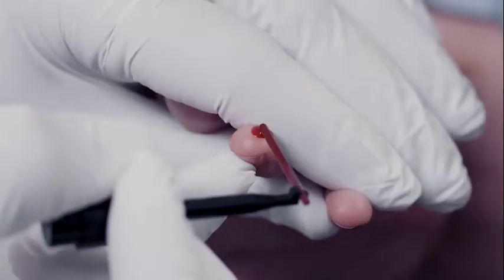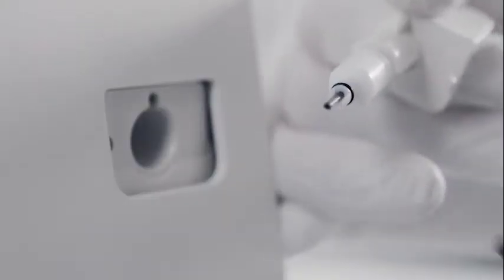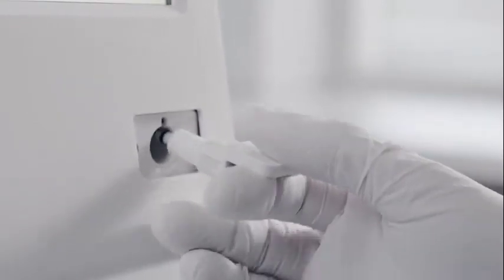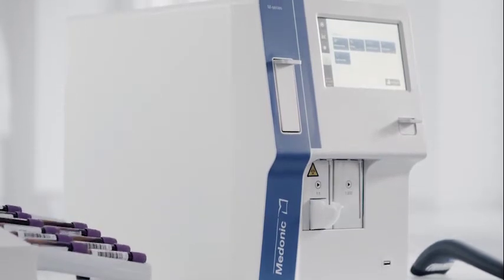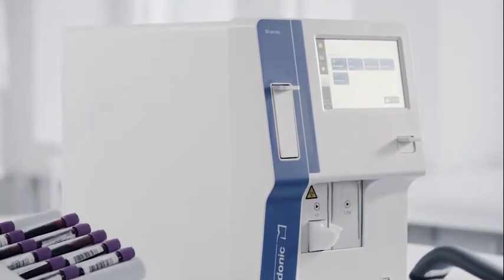Moreover, Madonic M32 is the only analyzer to offer the MPA, a micropipet adapter, where you introduce a drop of capillary blood directly into the unit. This means an entire CBC plus three-part diff from just 20 microliters of blood.